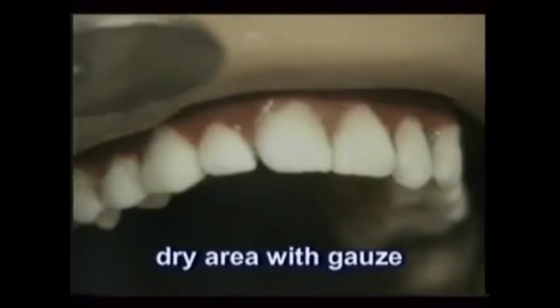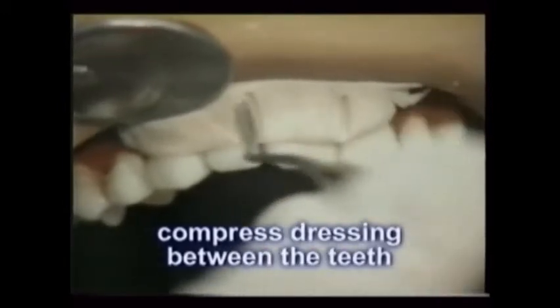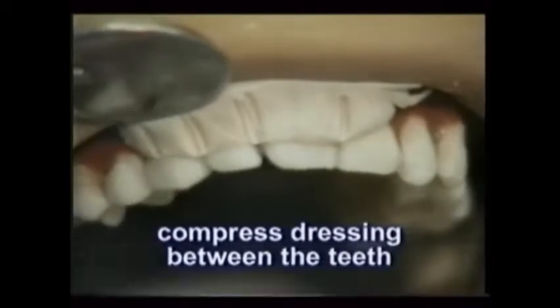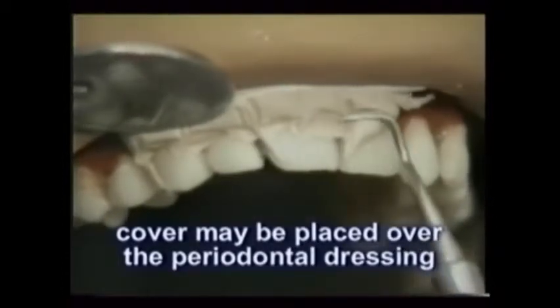Some states allow the dental assistant to place the periodontal dressing. When placing the packing, first blot the sutured area dry with sterile gauze. Then place a small roll of the periodontal dressing along the outer necks of the teeth. Using a plastic filling instrument, compress the material in between the teeth, then repeat the procedure on the inside, forcing the packing through the interproximal spaces and connecting it with the front roll. Once placement is complete, use a scaler to carefully trim the excess packing away and remove the excess with cotton pliers or gauze. A final rinse of warm water completes the procedure. A thin foil or plastic cover may be placed over the packing to help keep it dry until it's fully set.